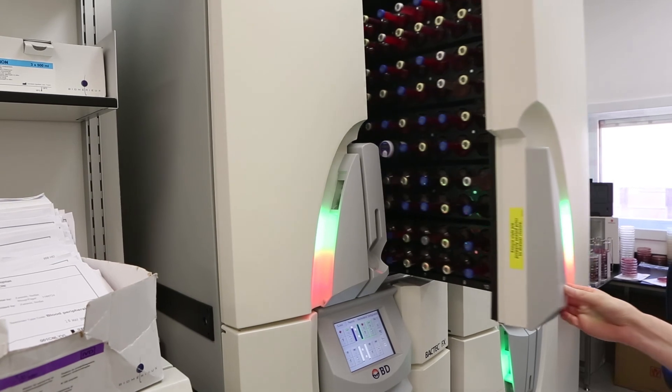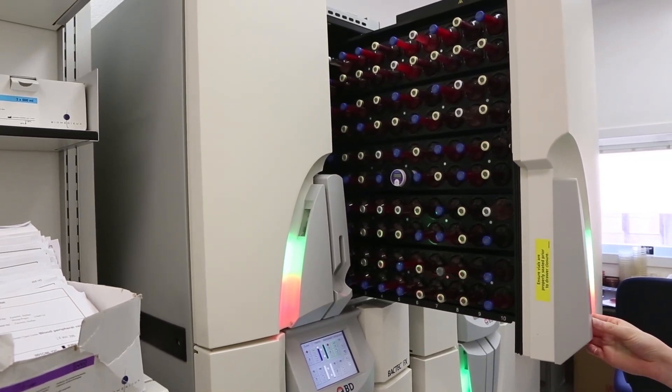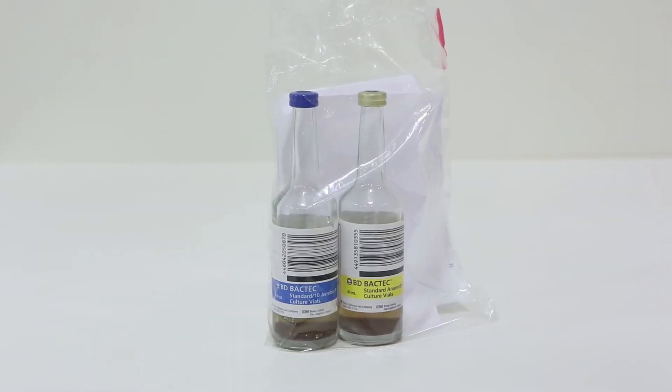Do not stick and then remove the label from the bottle's underside as any residual glue may interfere with lab equipment. A request form should accompany each blood culture bottle. Do not use a pneumatic tube system but hand deliver the sample as soon as possible to the pathology reception.